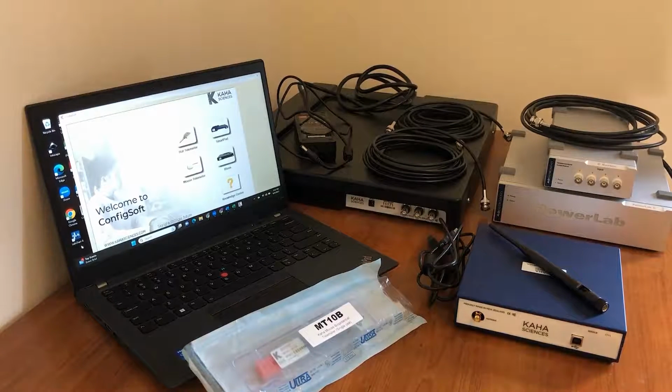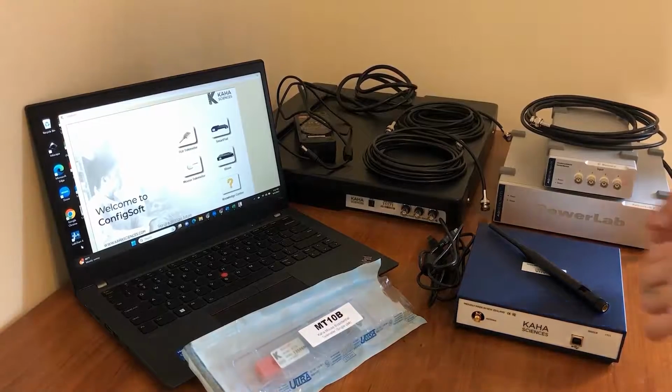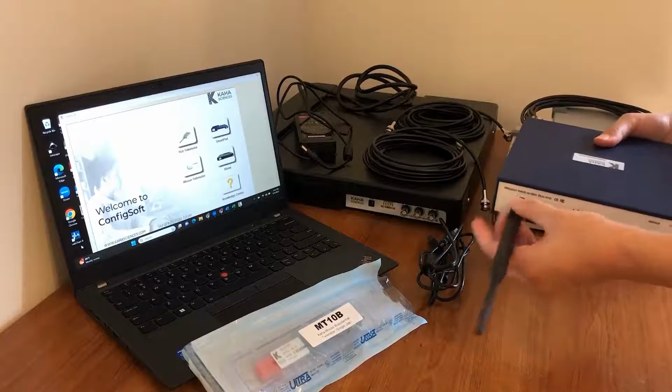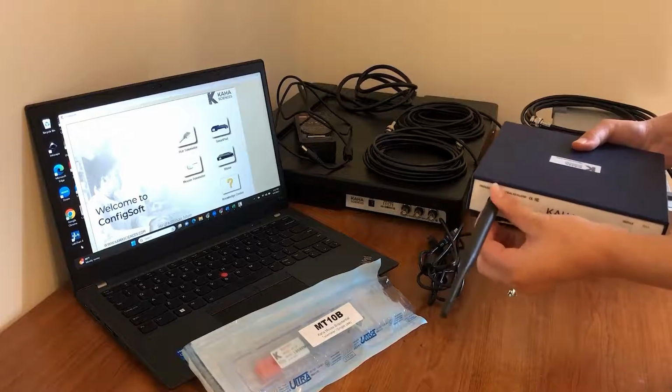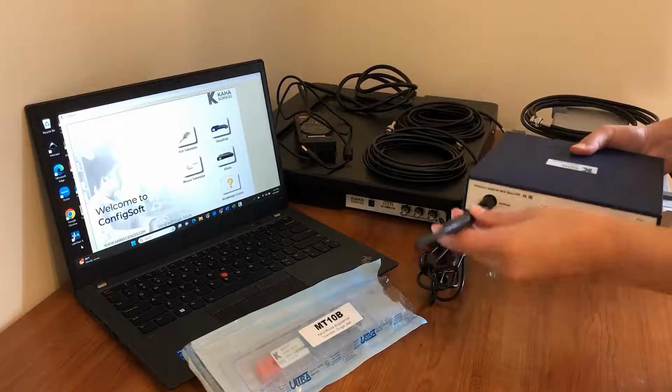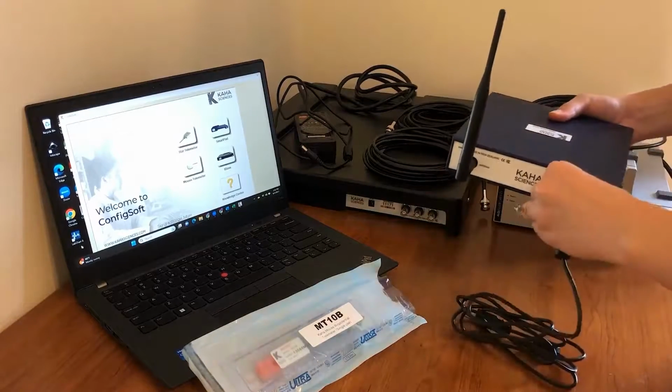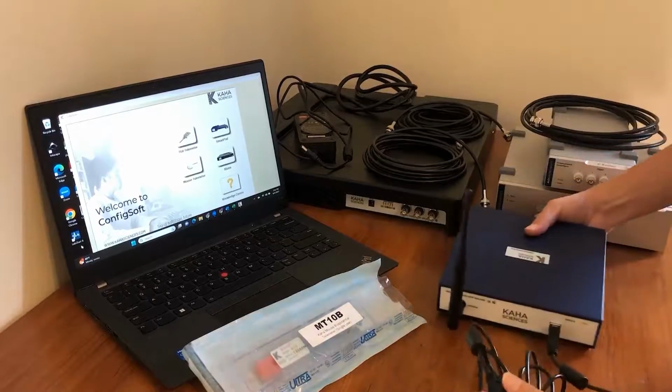Now, before we connect any of the hardware together, the first step we'll want to do is install the ConfigSoft software on our computer. I have mine already installed, but this is a very simple process as you will receive a USB drive with the software on it for you to easily install on your computer. Next, we will set up the configurator by first attaching the antenna to the back of the unit. This screws in nicely, and then once it's tight, you can flip the antenna up. And then next, you'll take your cable and you'll plug it into the computer.